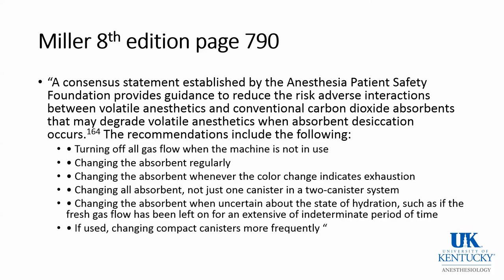Second, that absorbent be changed regularly. Third, that the absorbent be changed whenever the color change indicates exhaustion, although one must be aware of the fact that the color can become faded and you may miss the fact that it has become exhausted.